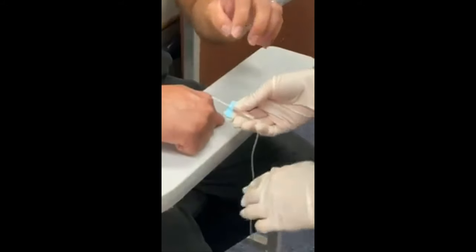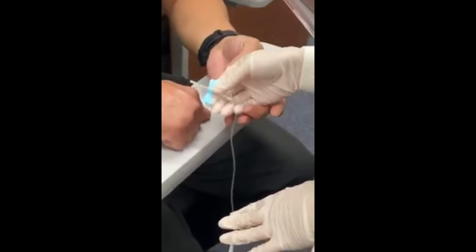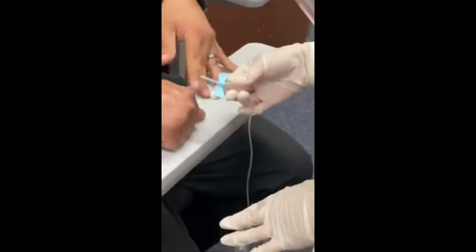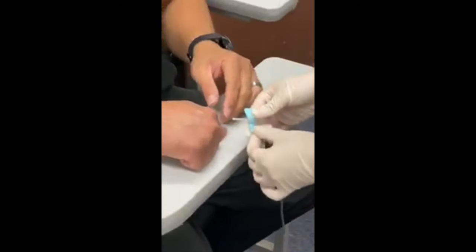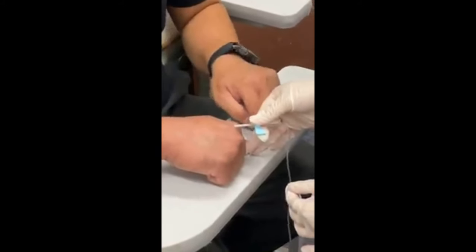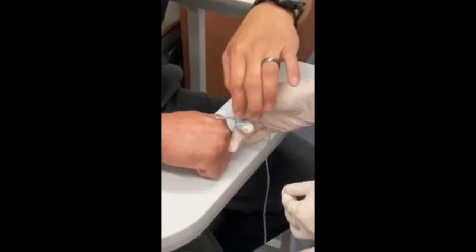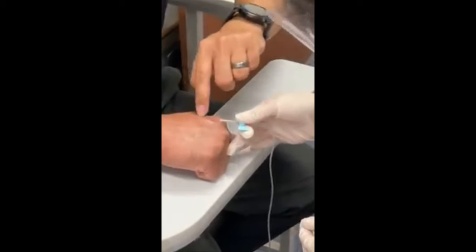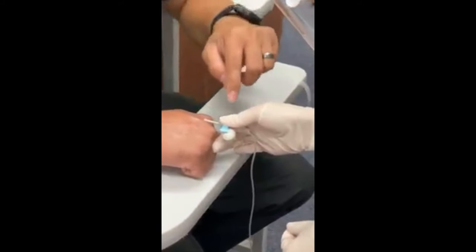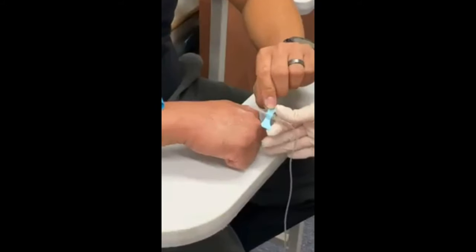So the way you would do it is you would rest your finger. Okay, so maybe with this one it's kind of different. So you would have to maybe stretch it like this. Yeah, just like that. As long as you're either touching the patient or here is fine, because as long as they don't move. So when you go in, you would just follow the path here. Yeah, just like that. Perfect. And then just keep in mind the black button, just at the tip there.